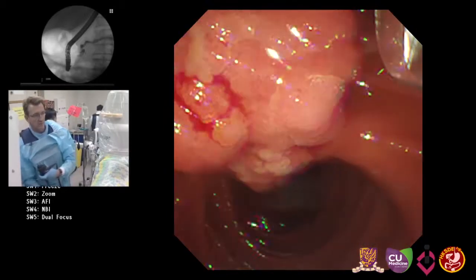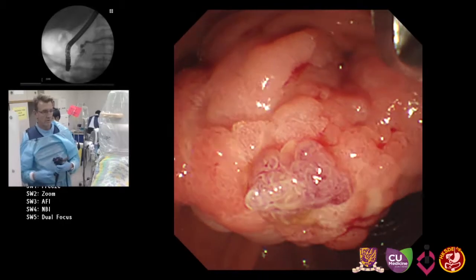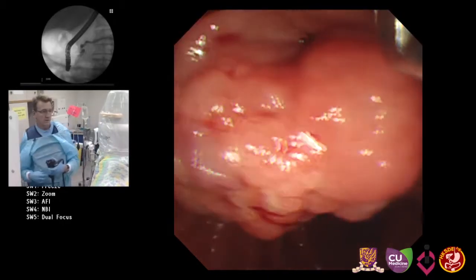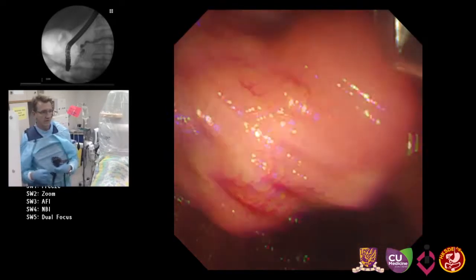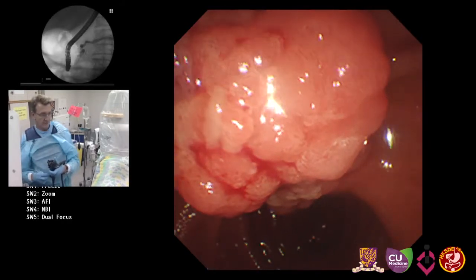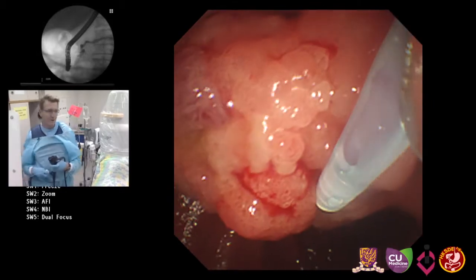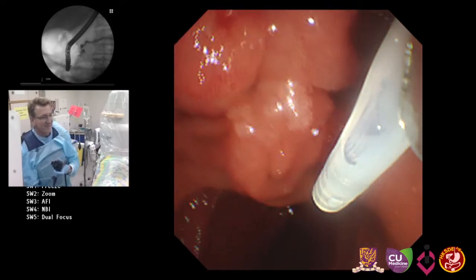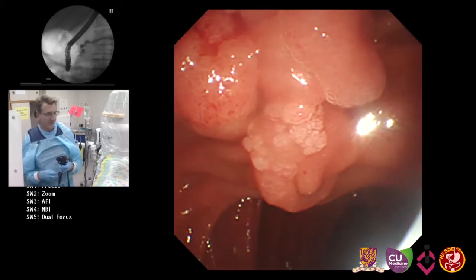Mike, one quick question. For you, it does not look daunting, but for beginners, they still think it is a daunting task to accomplish. This one is very large. Yes, it's a large lesion, so this shouldn't be your first ampullectomy. Start from the benign-looking smaller ones first, and then you work your way up.